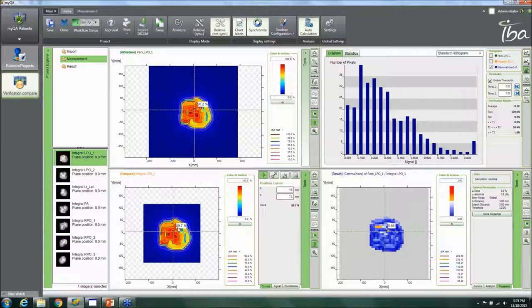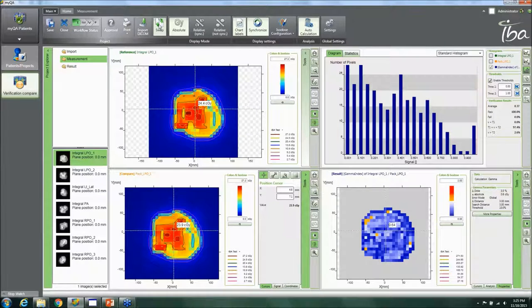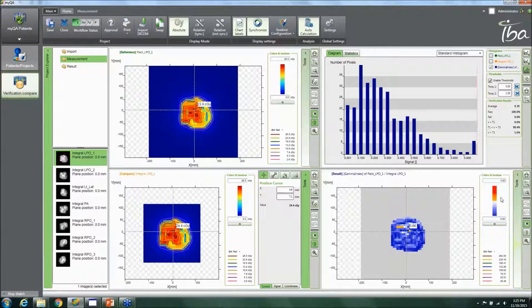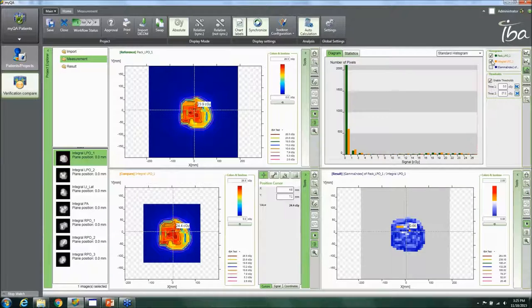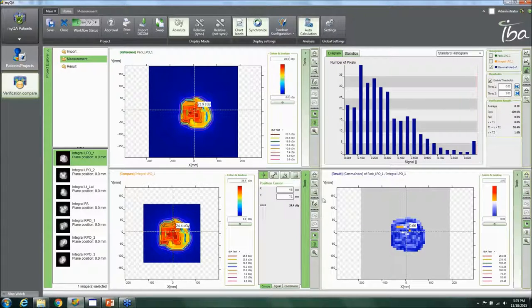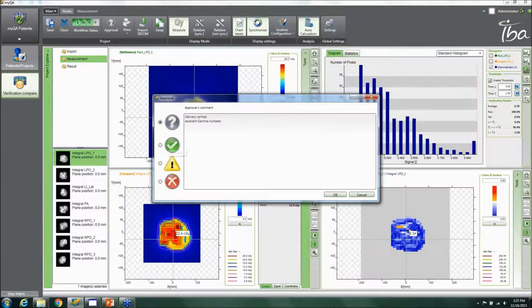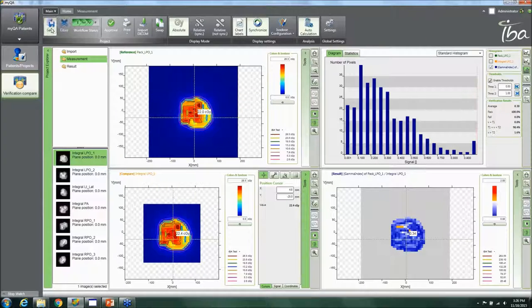You can quickly swap the measurement and reference planes if they were accidentally placed in the wrong panes. You can also adjust histogram thresholds. When analysis is complete, you mark the plan as verified, add a comment such as 'excellent gamma numbers', approve the plan, and save. If you close without saving, the software prompts you to save as well.